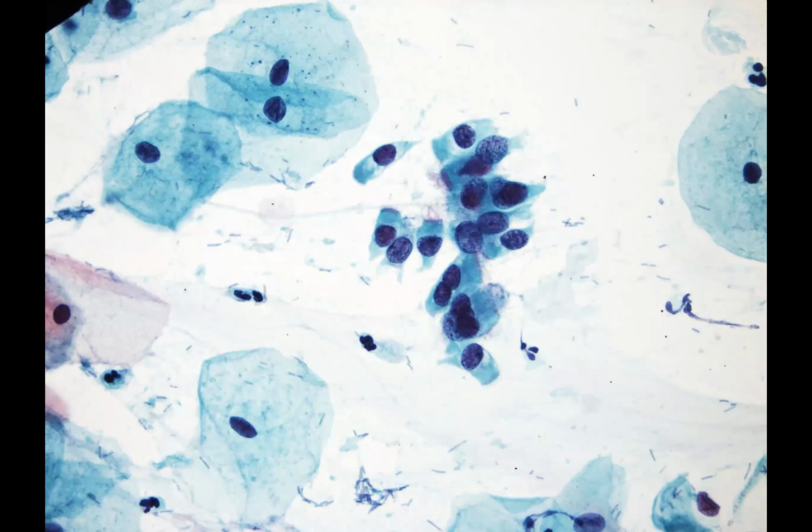Now, I will talk about some of the features here in a coming slide, but again, this is not high-grade CGIN. You shouldn't be worried by this as being query endocervical dyskaryosis. What we're looking at here, we've got a range of appearances. These are all columnar cells, okay? The nuclei in these instances are, I would say, in the lower third to the middle third of the columnar cells.